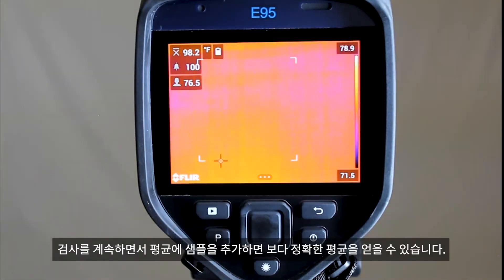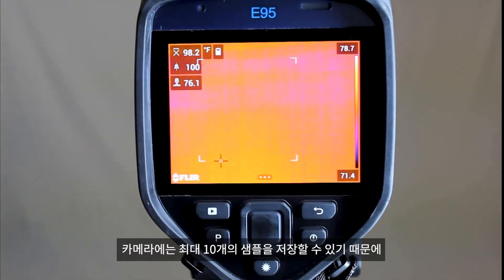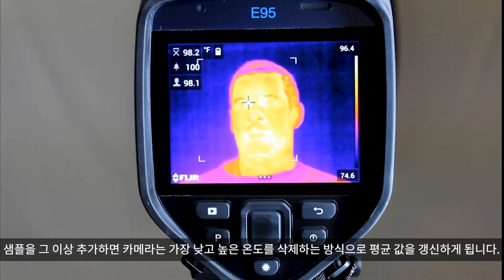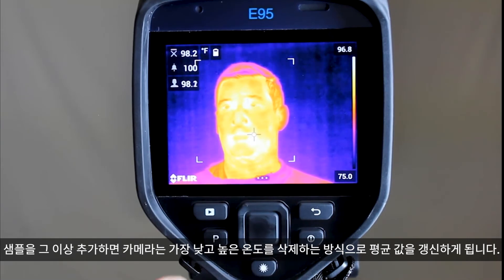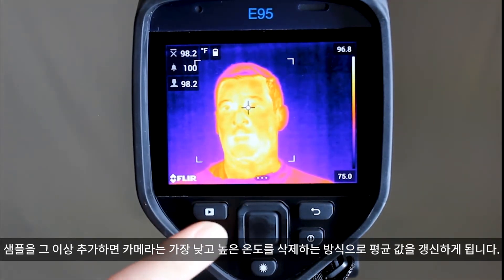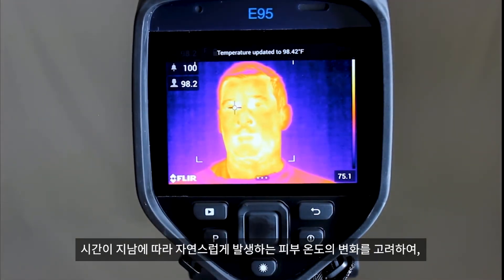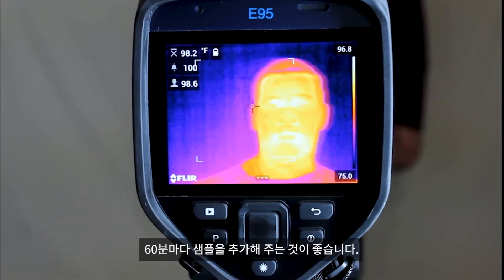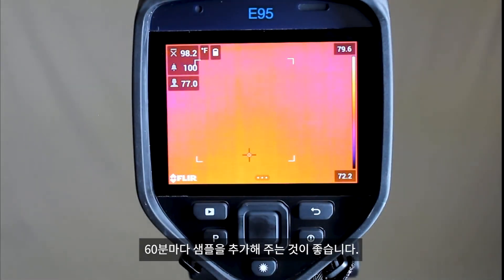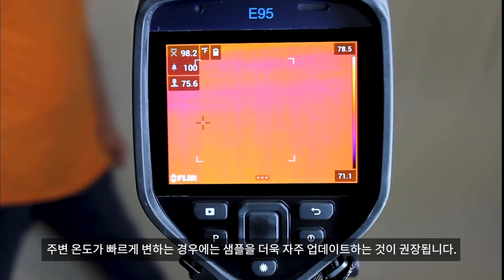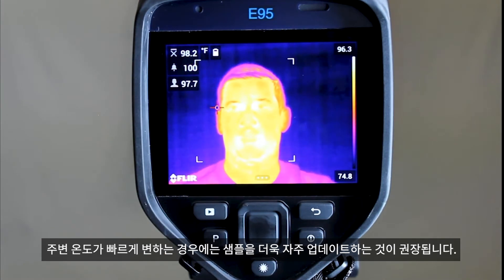As you continue screening, add additional samples to your average. Your camera can store up to 10 samples and will begin dropping the coldest and hottest when additional samples are added. Adding additional samples should be done every 60 minutes, to factor in changes to skin temperature that occur naturally over time. If the ambient temperature is changing rapidly, it is suggested that you update more often.